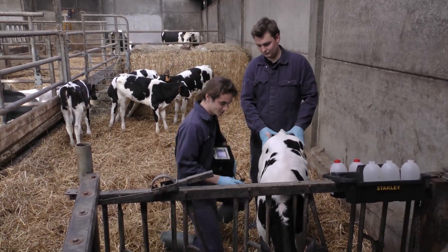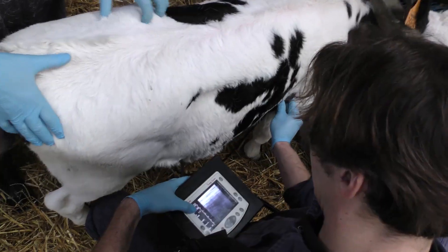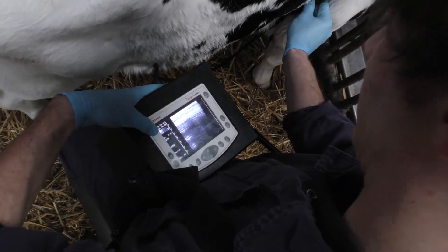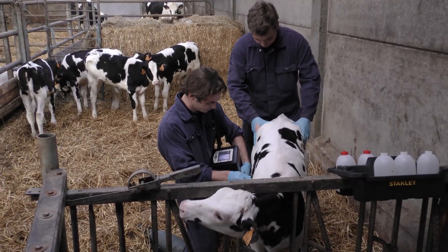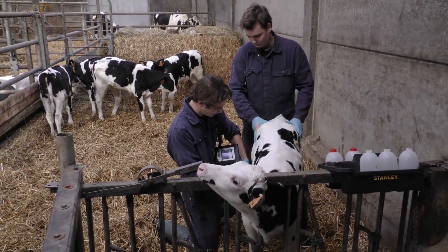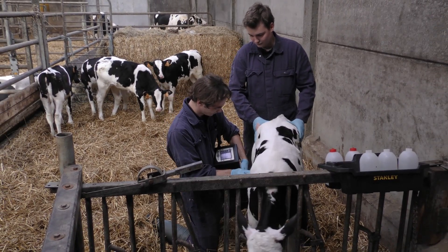We zetten ons naast het kalf en we gaan eigenlijk oriënteren naar ons startpunt. We beginnen met een startpunt en we plaatsen onze probe zodat we geen ribben in beeld hebben, maar enkel het longoppervlak zien.